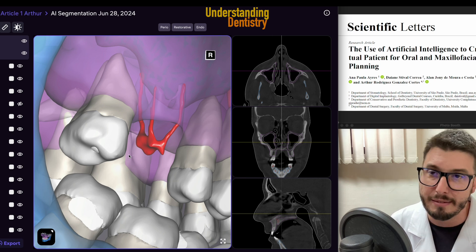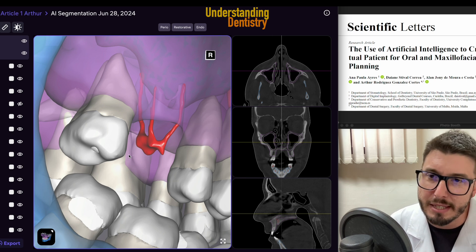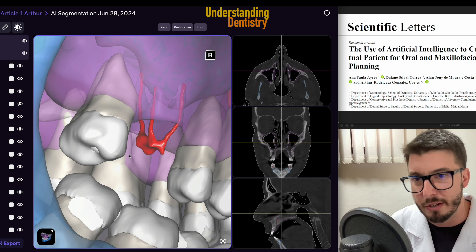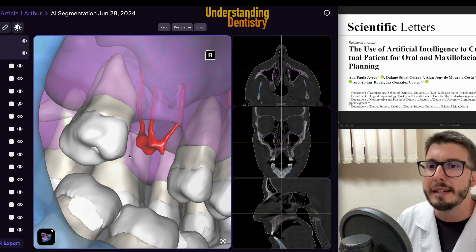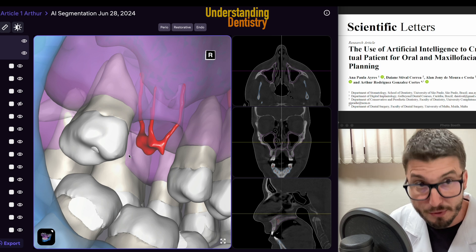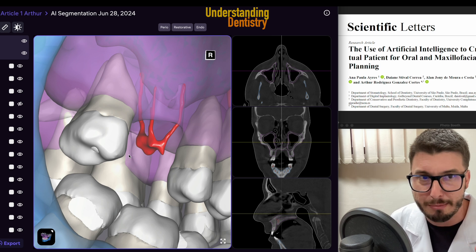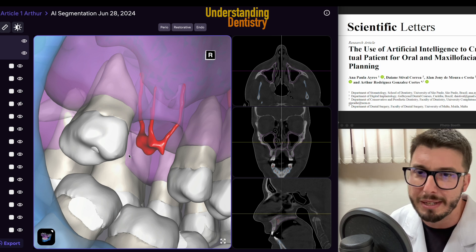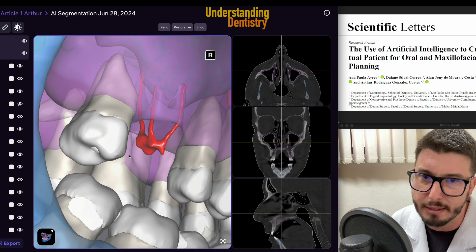This is a big CBCT with a big field of view. If we have a smaller field of view, the image quality can be enhanced, so we cannot forget about that. That's why you also have a recommended reference here.